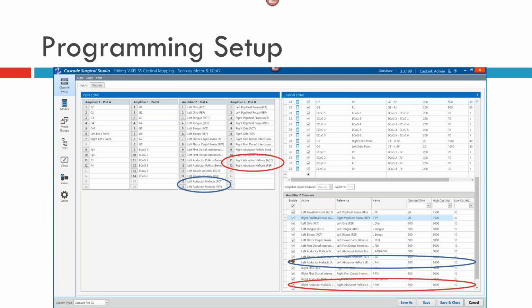If you're doing a programming setup, all the pictures I've put are because we are moving to a new platform very soon, and it's Surgical Studio. So instead of doing it live, I just put the pictures. If you open the new Surgical Studio, once we start doing that, we are not doing it right now, we're just testing. The window will look like that, and you will have electrodes on the left side, and then montages on the right side.